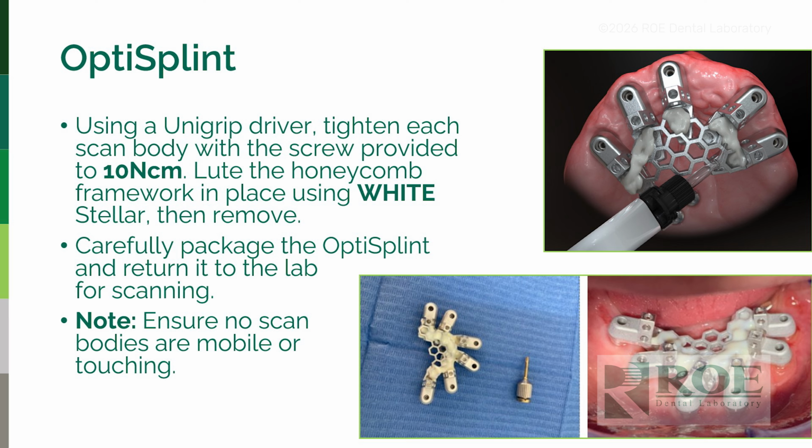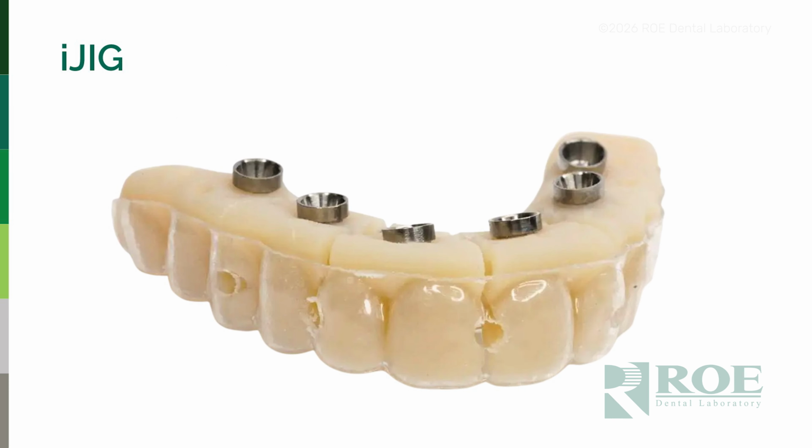You have a manual or an analog verification process, which again, we go back to the comfort element, that some people like the comfort of that because they've checked it themselves in the mouth. And the lovely thing about Optisplint is that you can have various restorative options. You can have Passivity Plus. You could potentially even go direct to MUA. It is accurate enough for us to do that. So Optisplint is a really good option.